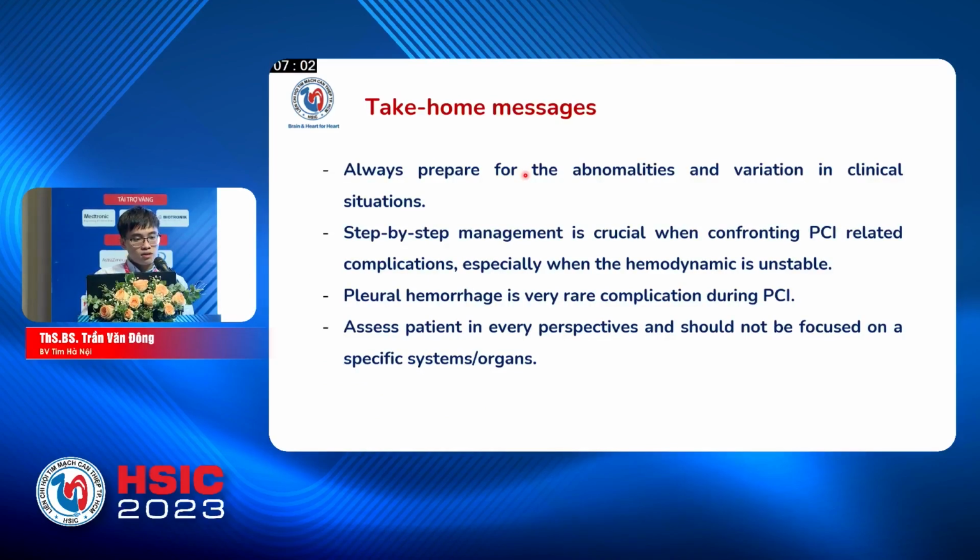So the lesson from this case is that we have to always prepare for abnormalities and variation in clinical situations, and step-by-step management is crucial when confronting PCI-related complications, especially when the hemodynamics are unstable. And we have to assess the patient from every perspective and should not be focused on a specific system or organ.